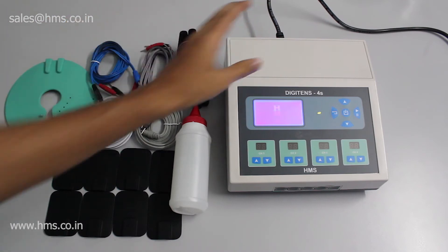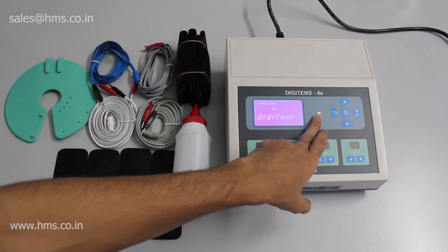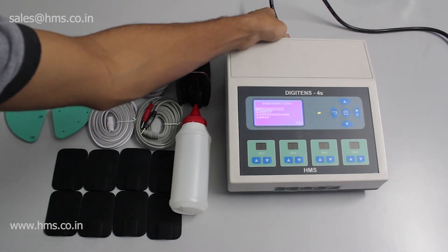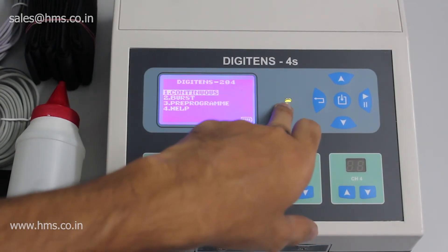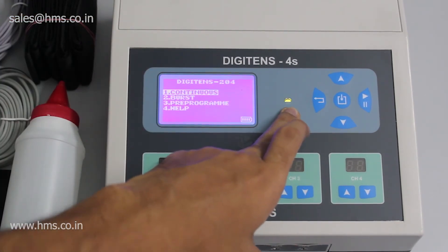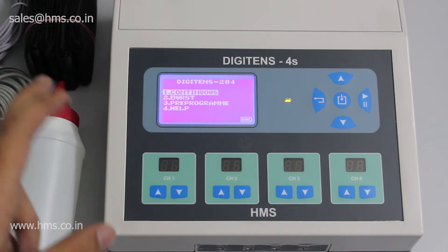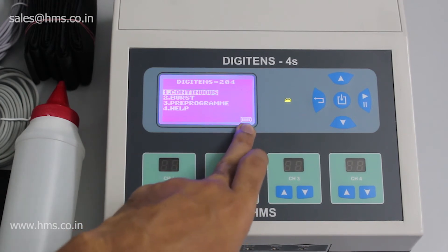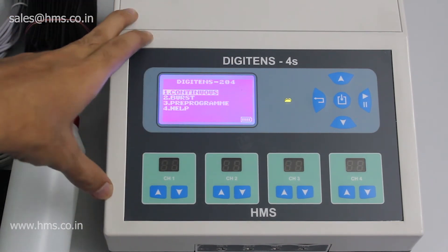I'm switching on the equipment now. As mentioned, it's both battery and mains operated. This indicator shows whether the battery is charging or the equipment is operating in battery mode. I'm unplugging the mains cable — the equipment is now operating in battery mode. The battery indicator glows green when running on battery and turns orange when the battery is low. You can also check the battery percentage on the display, similar to a smartphone.